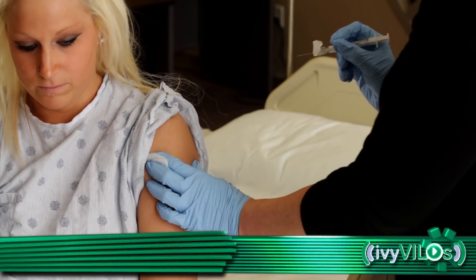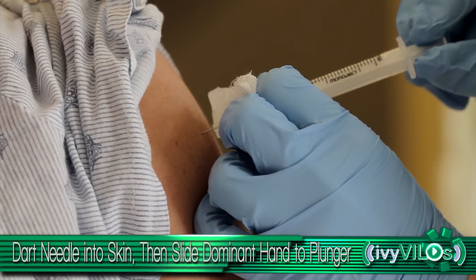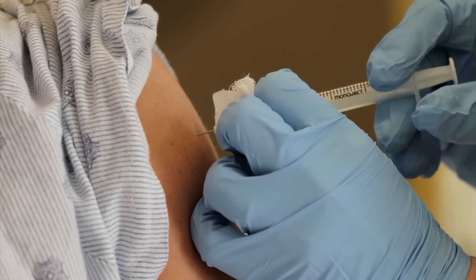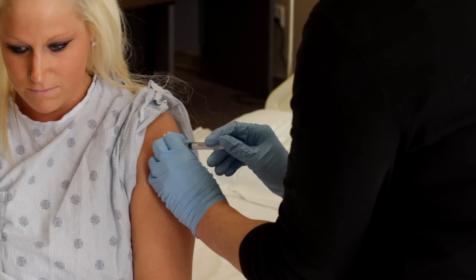Dart the needle into the tissue quickly. Once the needle is in place, use the thumb and forefinger of the non-dominant hand to keep the lower end of the syringe steady. Slide your dominant hand to the end of the plunger. Inject medication slowly. Once medication has been injected, wait 10 seconds before withdrawing.